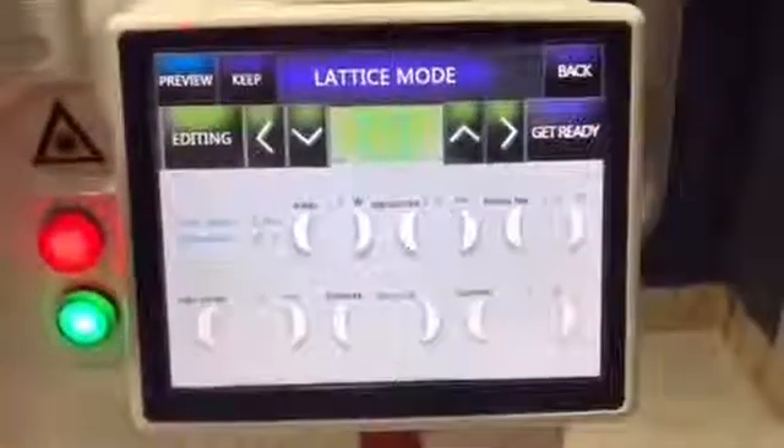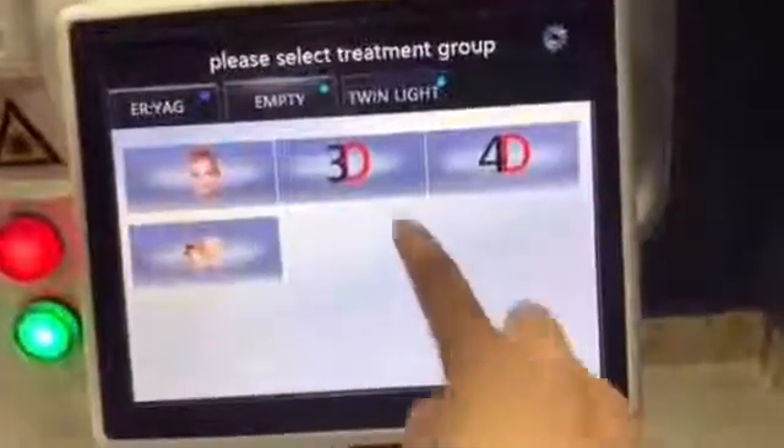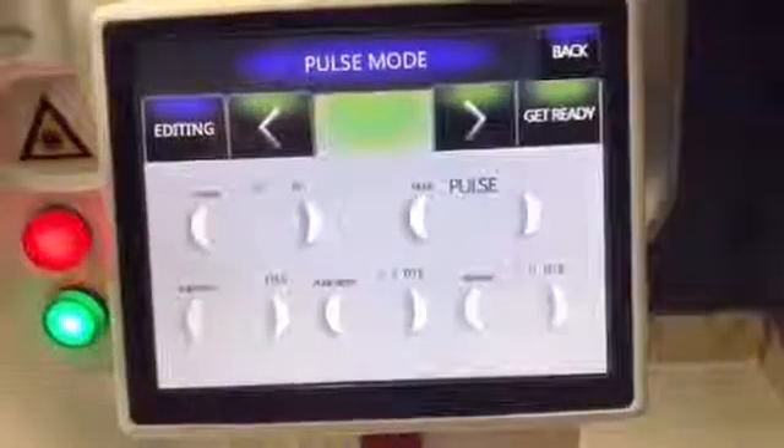Stop. Back. Pulse mode — this mode is for the treatment of mole removal.